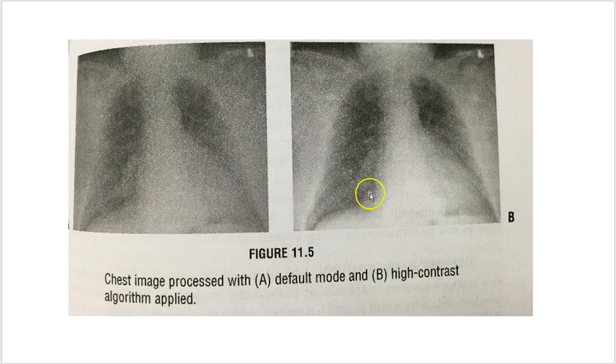Then take out the lungs, the black areas, just the lungs, and do contrast on them. Then subtract out the heart, this white blobby area here, and do contrast enhancement on just that. Now once you've contrast enhanced each individual structure inside that image, then dump it all back together, put them on top of each other, so you basically get a layered stack of images, all of which has been contrast enhanced.